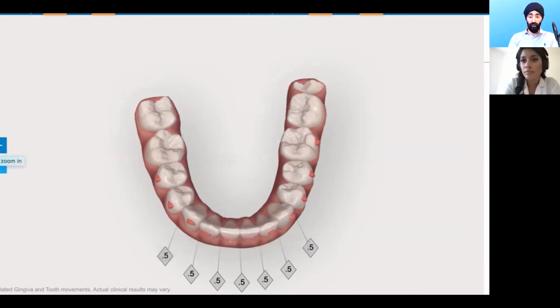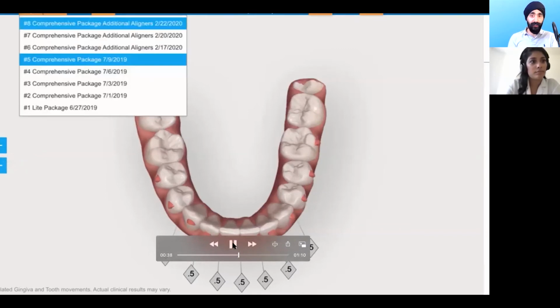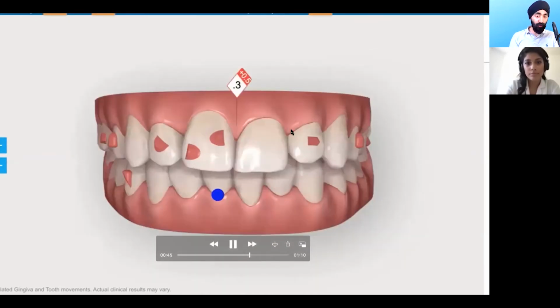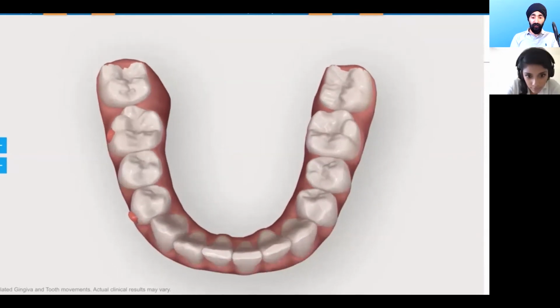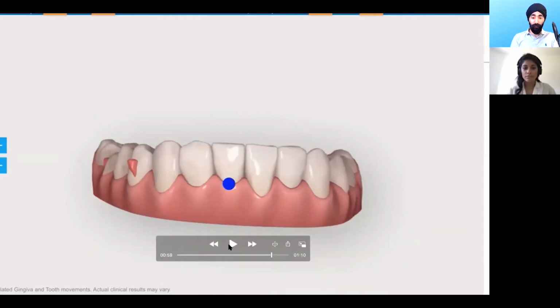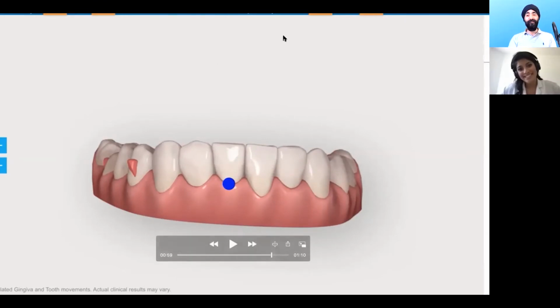So just to go through this case, that's how the ClinCheck, obviously, ClinCheck is cartoon orthodontics. It's not real ortho, so don't compare it to real life. It's just a guide. Anyway, we got this through one round of aligners. Okay, alignment so far. We're just going to do some additional aligners to get the torque correct. And you'll see here the asymmetry of those incisors as well. But it's not a bad result. So it's pretty good. Patient was chuffed. The patient actually wants to stop now. I'm like, no, it's not quite perfect yet. Let's just get that perfect and we'll be happy.